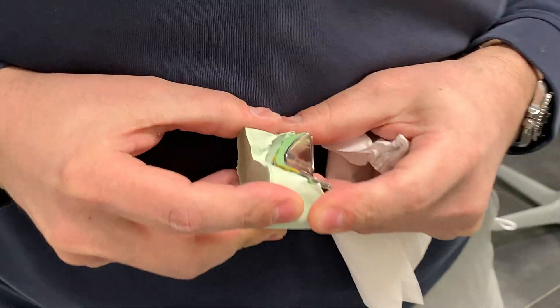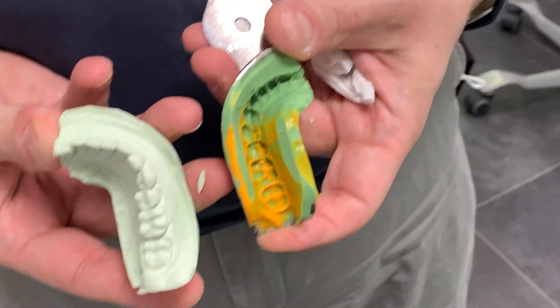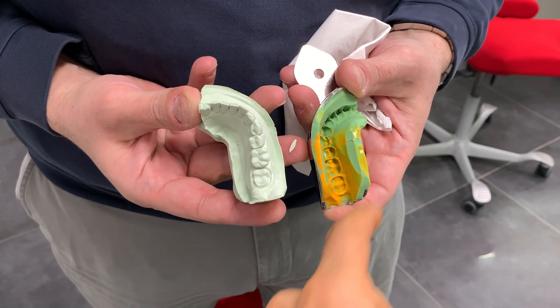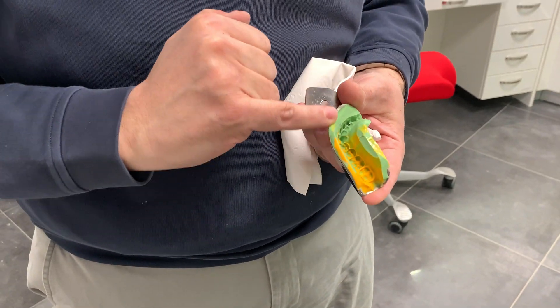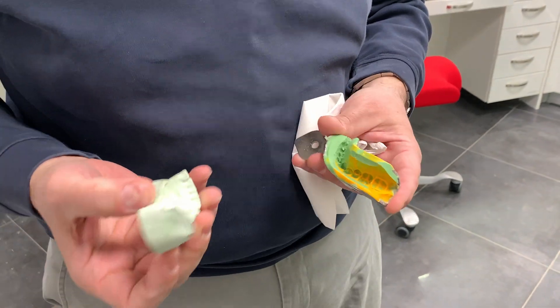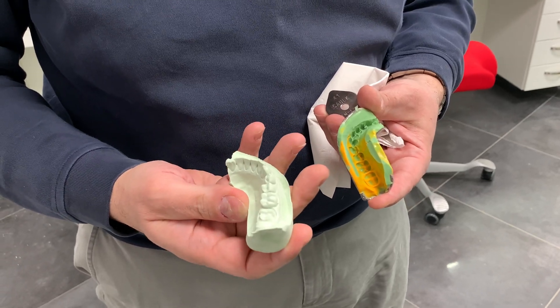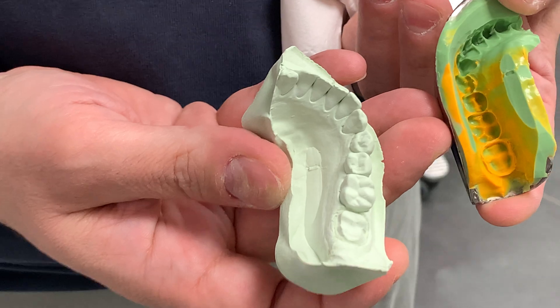It's important to trim your impression so you don't have any undercuts in there. You trimmed it with your blade and cleaned it up — you always want to trim, and use minimal pressure to remove it, otherwise if you had a big undercut it would be very difficult to remove. And that's it, nice and easy.